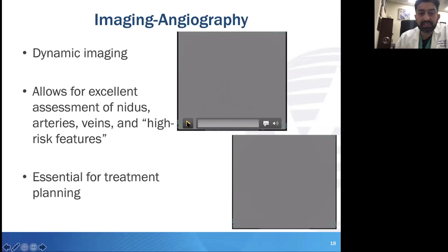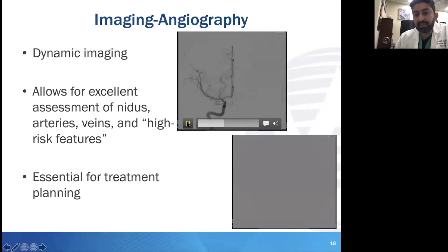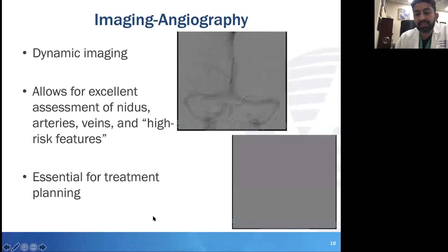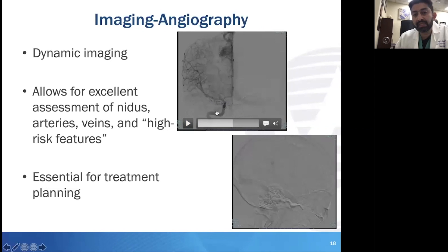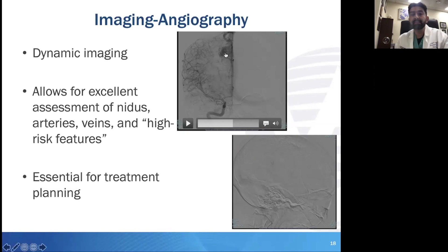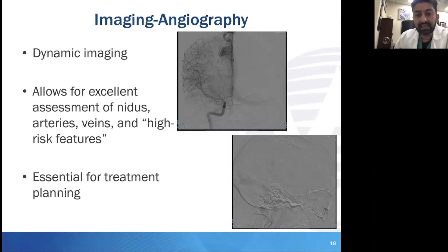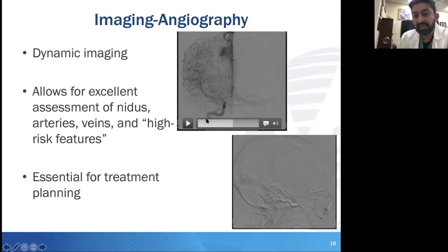These angiograms are showing AP and lateral projections — what I need to see in terms of angioarchitecture. Clearly, you can see here this is an ACA and MCA distributed AVM sitting just adjacent to the posterior Falx. You can appreciate in real time the inflow and outflow of the arteries, as well as that superficial draining vein.